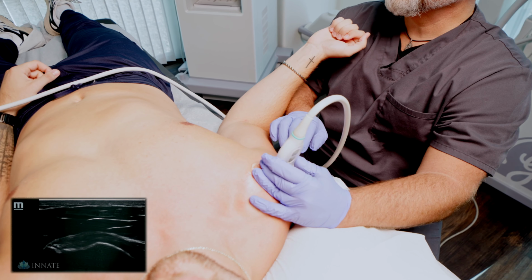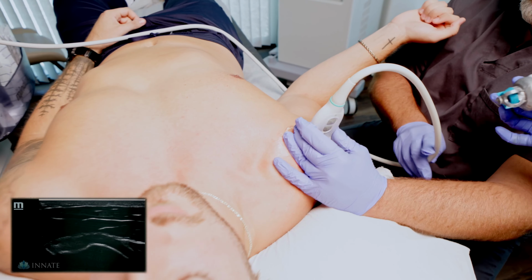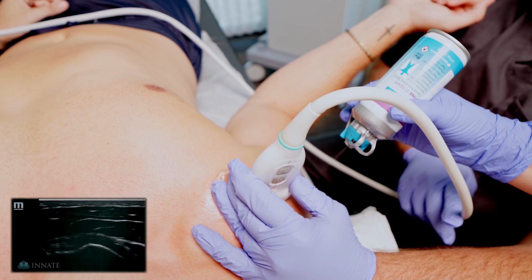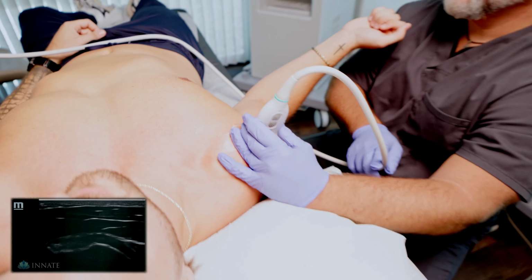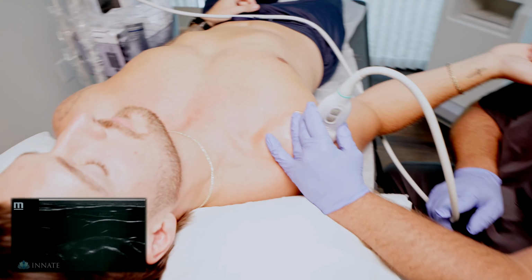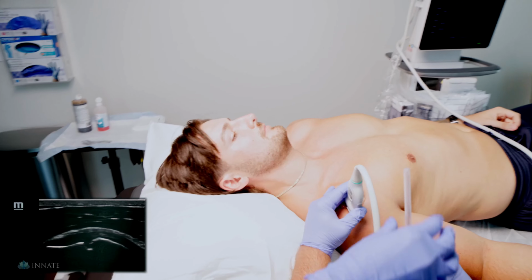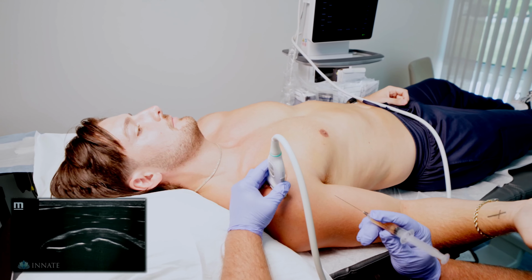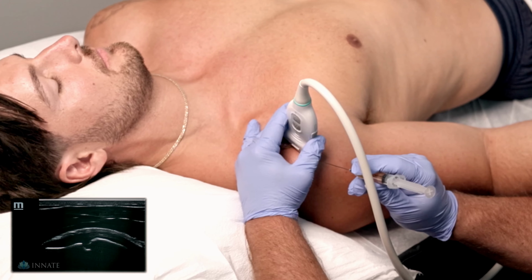Right in through here. So we're gonna do some cold spray to help numb him up. Perfect. There's that cortical irregularity right there. I feel a little pinch. 1, 2, 3, and pinch.